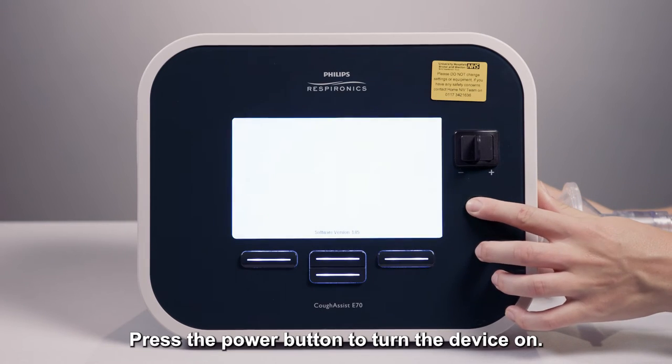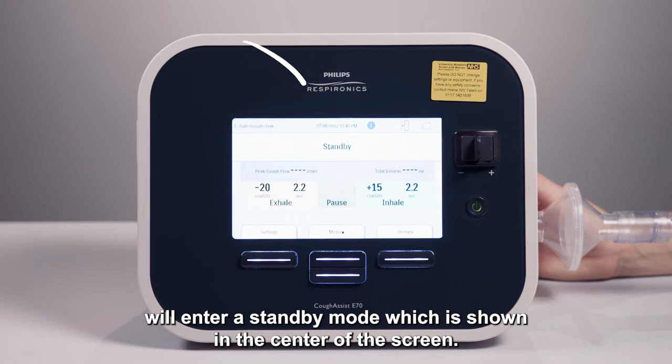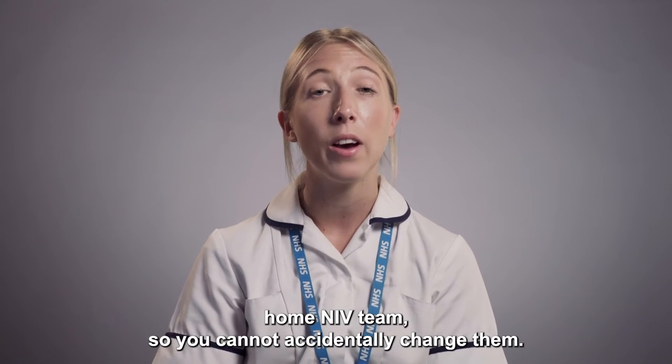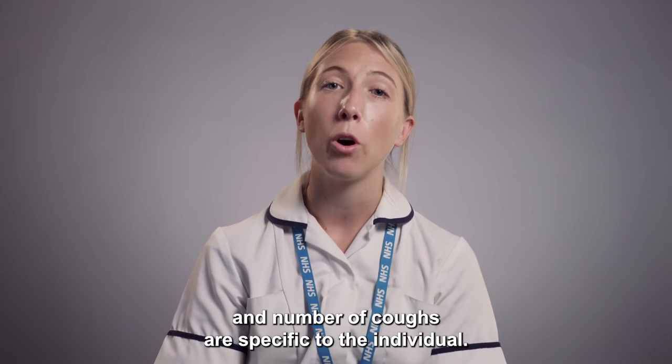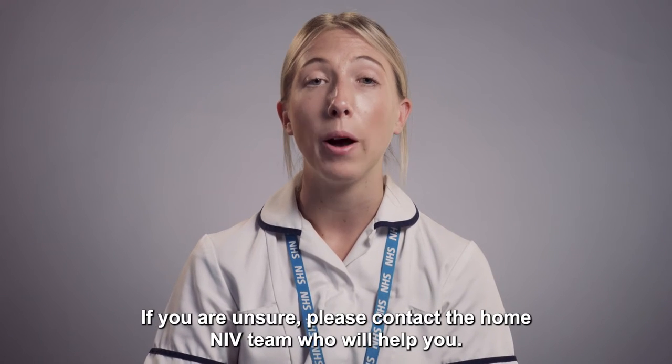Press the power button to turn the device on. The cough assist will enter a standby mode which is shown in the centre of the screen. The settings are displayed and have been set and locked by the home NIV team, so you cannot accidentally change them. The settings and number of coughs are specific to the individual. If you are unsure, please contact the home NIV team who will help you.